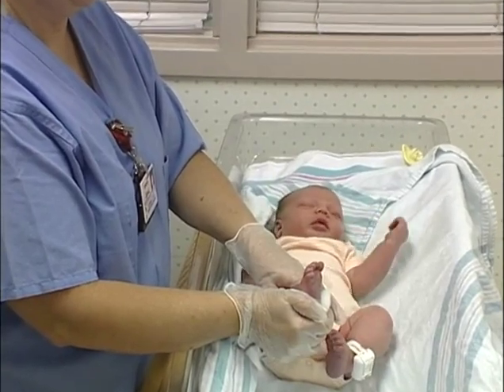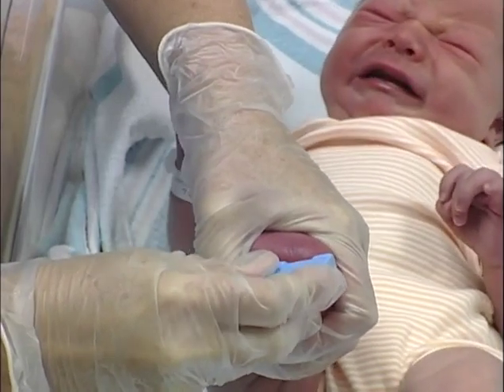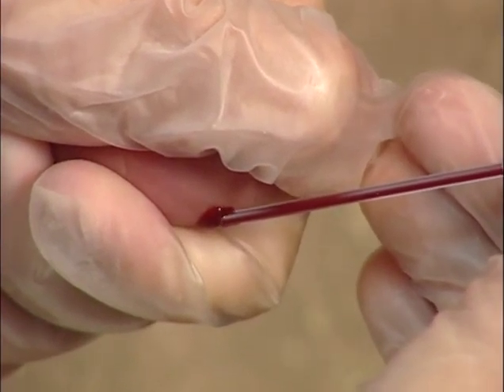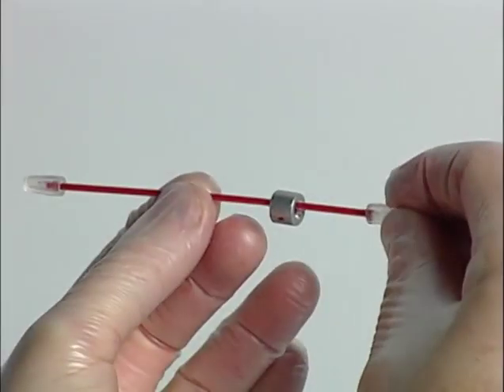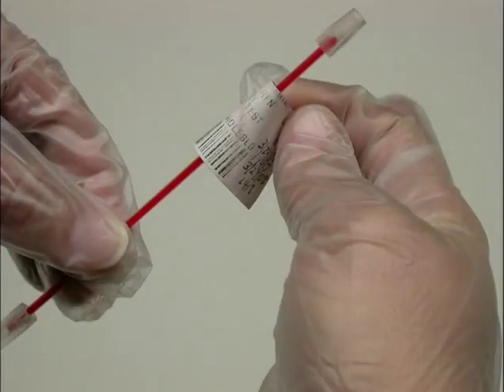For capillary collections, pre-warm the site. Cleanse the site and perform the puncture, wiping away the first drop. Without squeezing, collect the specimen into a heparinized capillary tube. Seal and mix the tube, making sure there are no air bubbles. Label the specimen and transport it for testing.